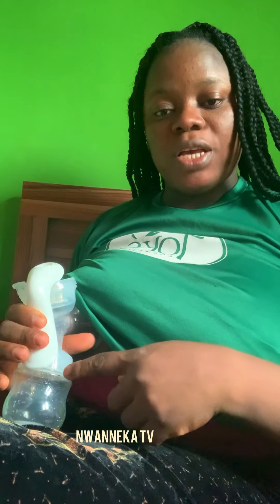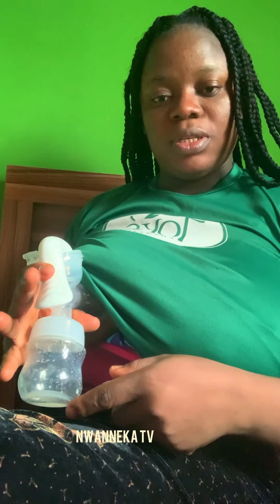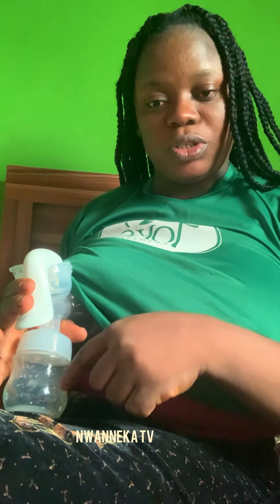This is how you pump — can you see the breast milk dropping? Can you see? When you hold it down it takes the breast milk, and when you release it, it puffs. Do you see?